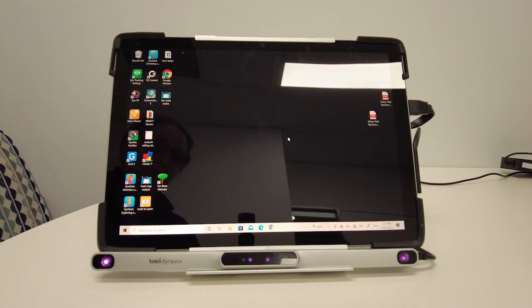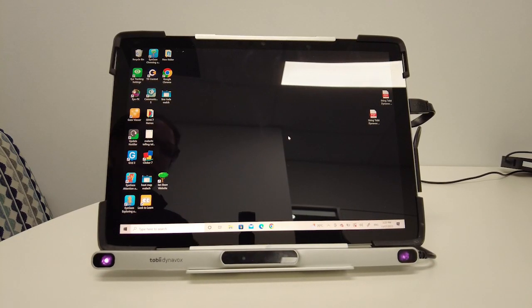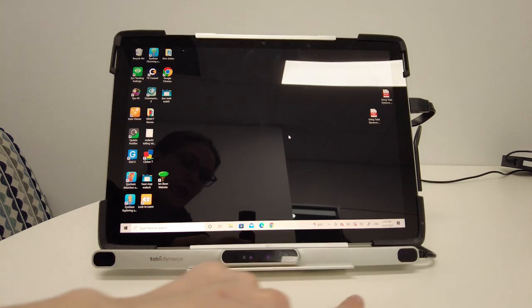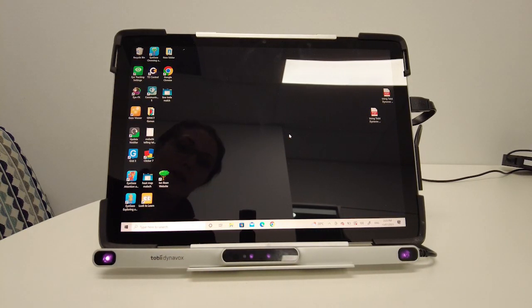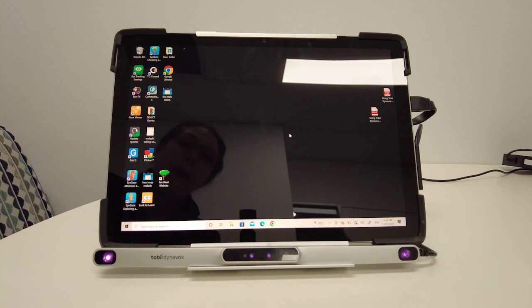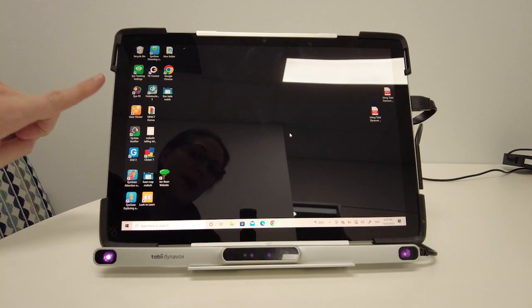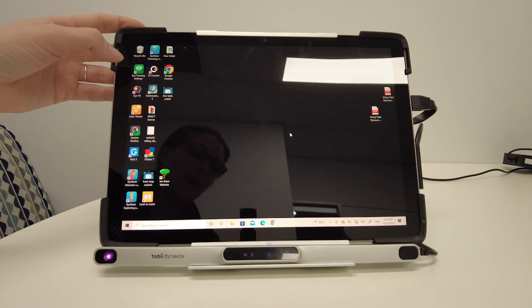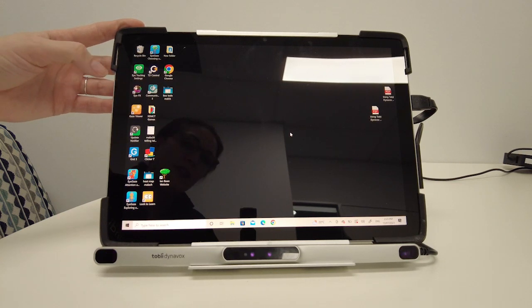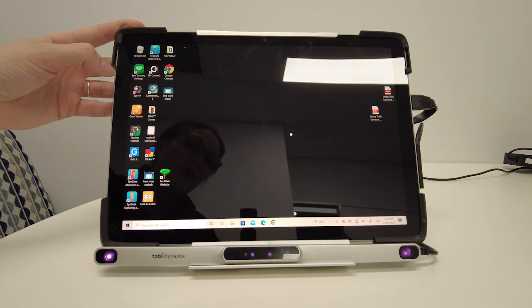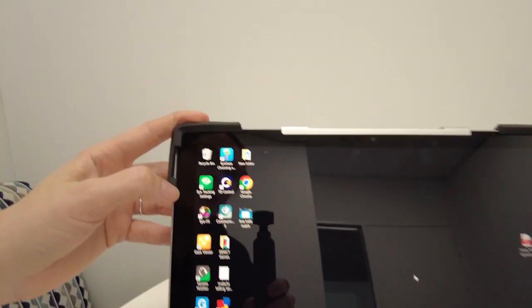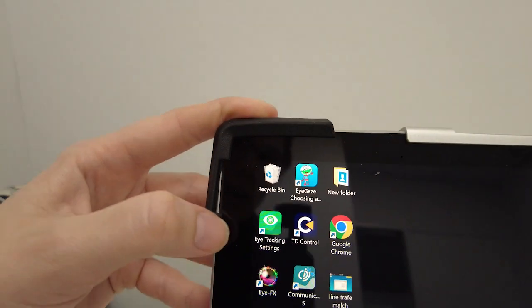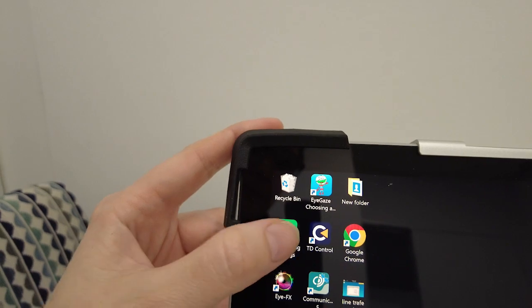If you're using a device such as the Tobii Dynavox iMobile 5 which doesn't have those shortcut buttons on the bottom of the screen like a Tobii Dynavox i13 and maybe you're not using grid so you might not have access to the eye tracking settings within that, there is an icon on the desktop where you can go to check where a user's eyes are positioned and calibrate and it's this green eye tracking settings icon here.